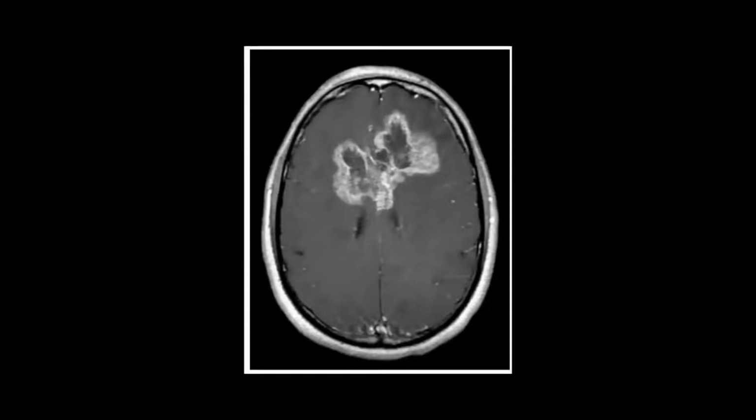Now, not all the PNETs are the same, of course. We have seen one type of PNET, which is the MN1 mutated astroblastoma, but we also have many other PNETs, like, for example, the glioblastoma multiforme with PNET features. Now, this one is not a glioblastoma with PNET features. This is a glioblastoma without PNET features. I put this one because I want to show the morphological difference between a glioblastoma without PNET features and a glioblastoma with PNET features.